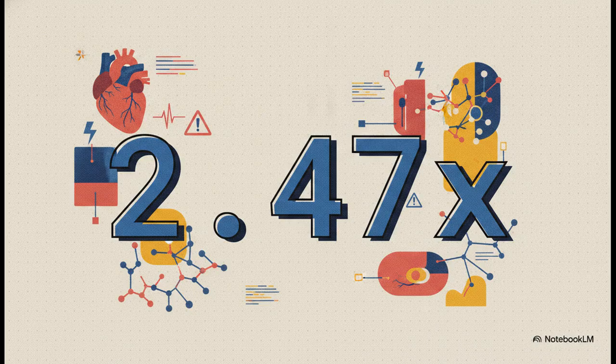If a patient had a completely normal PET scan, meaning absolutely no current perfusion defect, blood is flowing perfectly fine right now, but they had an abnormal AI-QCT ischemia result based solely on their plaque morphology, that patient still faced a 2.47 times higher risk of a primary endpoint event. And by primary endpoint, we are talking about hard clinical outcomes: death, myocardial infarction, or unstable angina.